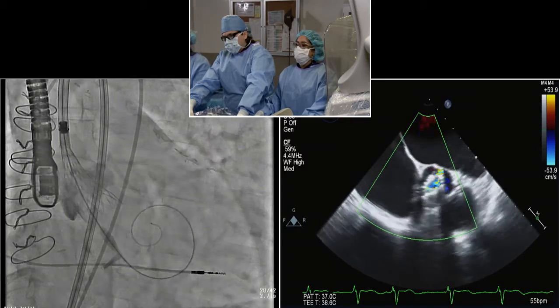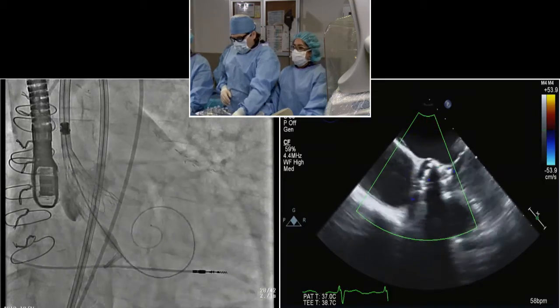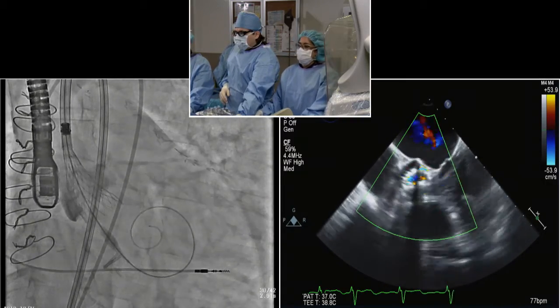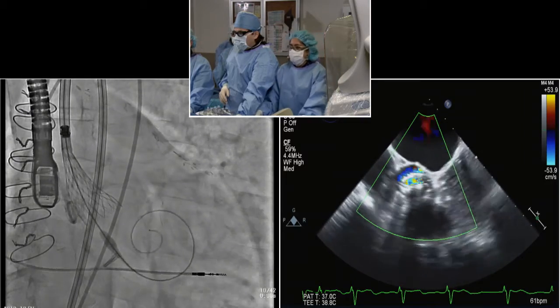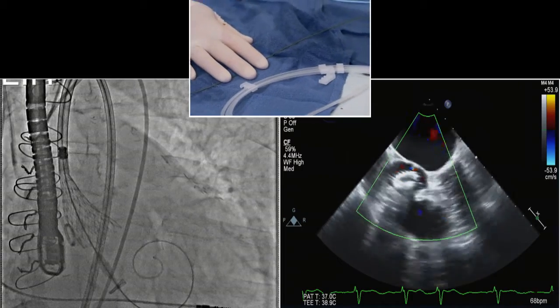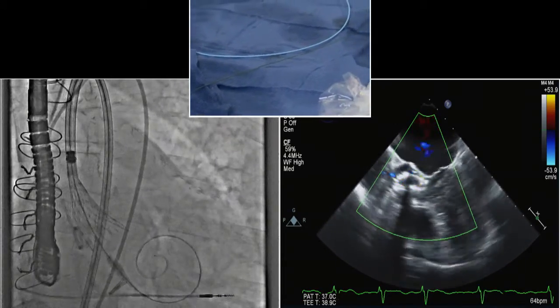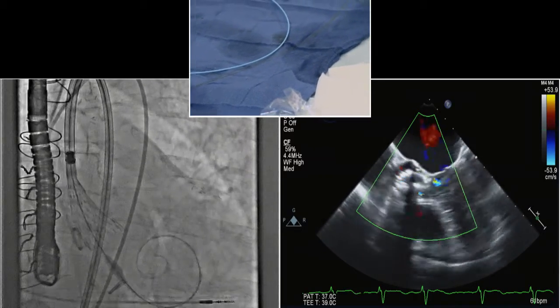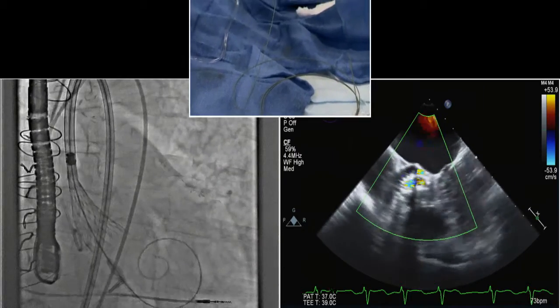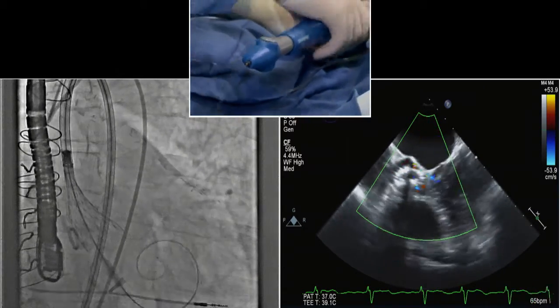But the property of this prosthesis is you can recapture, and you don't have to fully recapture, just reclose and pull back a bit. Along those lines, a very nice demonstration of that was at EuroPCR with Ian Meredith, where the valve was a bit deep on one side. In fact, he started to recapture, just slowly recapturing it, and the valve seemed to move up with slow recapture and then deploy. I've yet to use that, but I'm looking forward to a chance to do it.